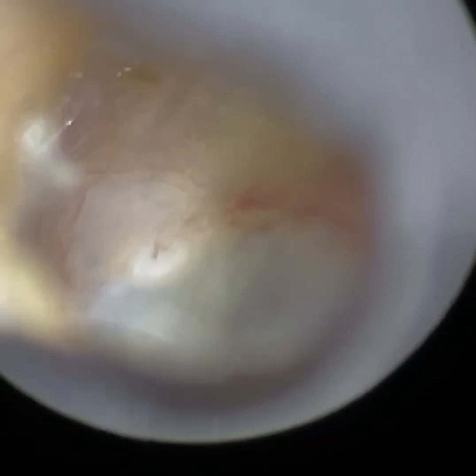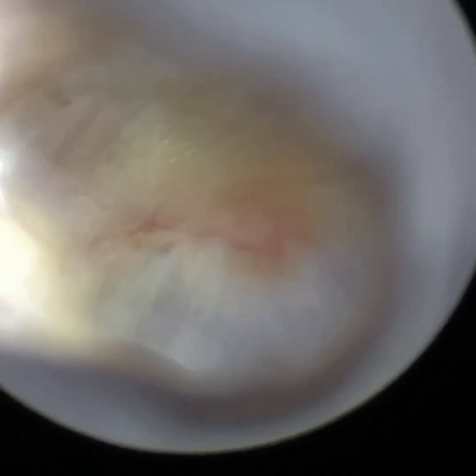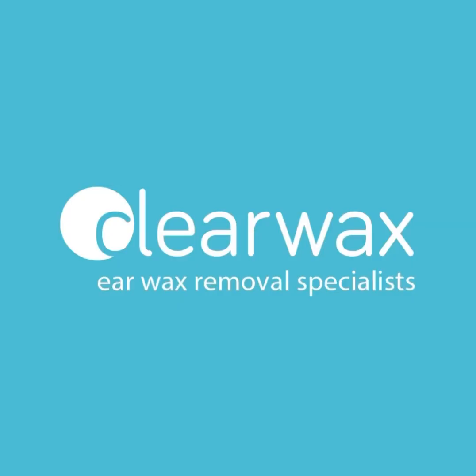Right near the eardrum there — we've removed some flakes of dry skin, and we're going to get a view of the eardrum in a moment. It's slightly tympanosclerotic, slightly opaque. You can see everything around you. That was another thing I had to get used to when not using the iClearscope — with a microscope, whether ENT, the Waxscope, or head loops, you do have to manipulate the speculum in the ear to view different parts. Well, I hope you enjoyed that video. If you are interested in purchasing the Waxscope, please email info@clearwax.co.uk. Thank you.